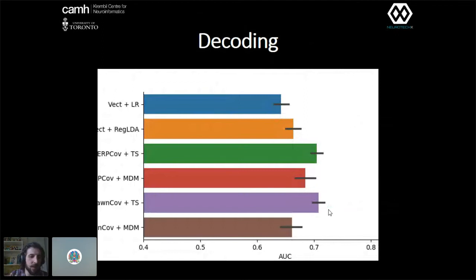Okay, decoding or machine learning. This is something that we're doing, and actually there are some cool projects on at this BrainHack, which is applying machine learning techniques to do classification of, for example, the faces and the houses stimulus sets or trial sets. This is an area that we're definitely interested in developing, and one of the reasons is because this is something that people can contribute to without having to have any of the hardware or do any streaming and any data collection.